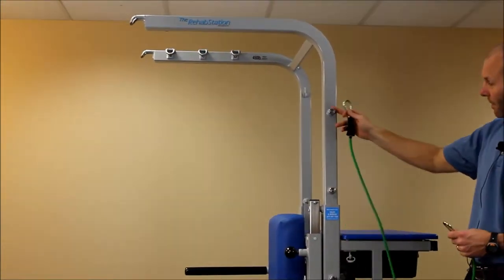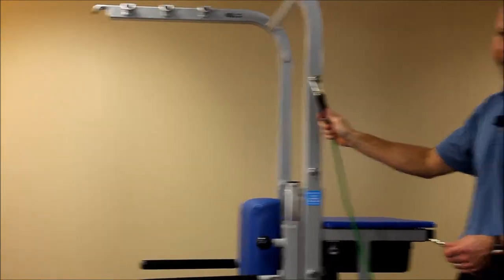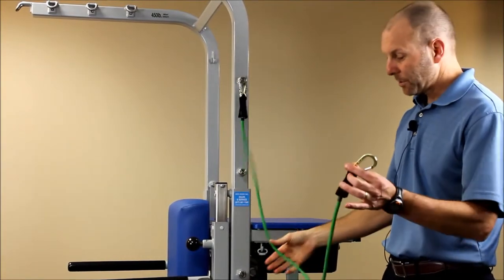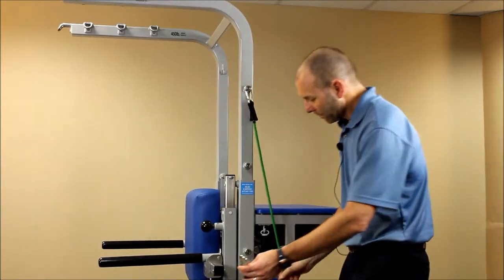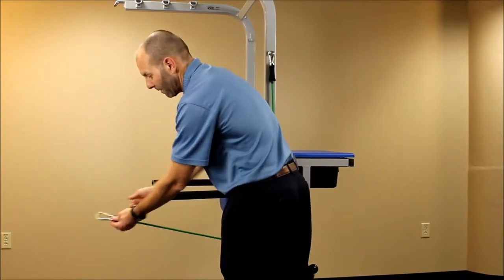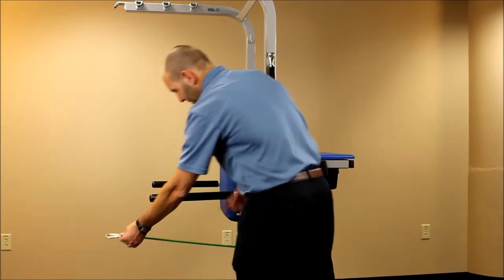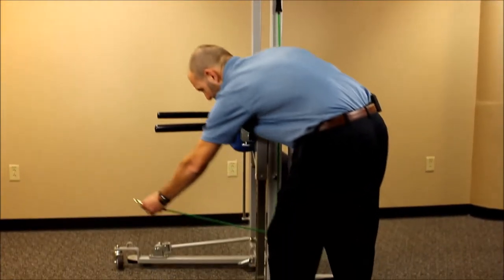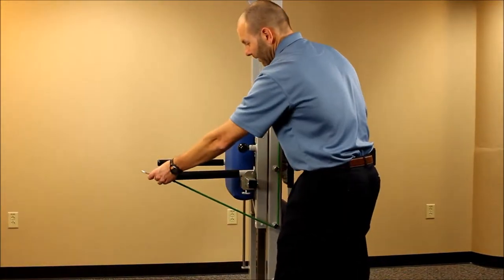Going back to the clips on the side — if you clip into peg one, and you're doing an activity where you want the resistance cord to come out more from the middle of the body with the person sitting there, you can take the cord and wrap it underneath peg four and then have the handle attached for the patient to utilize. You can adjust the angle of wherever you want the cord to come from by going underneath or over the top of any of the different pegs.